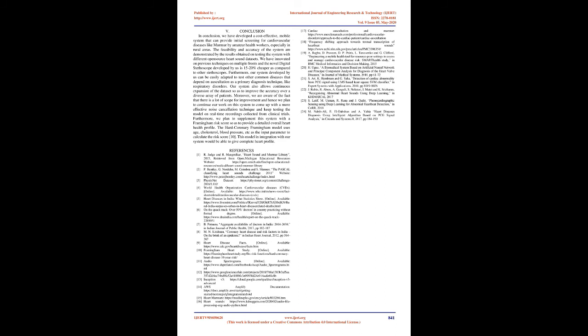PASCAL dataset B: 320 normal and 95 murmur files. After pre-processing, segmentation, and spectrogram conversion, a training set containing 91 images and a validation set containing 21 images was created. After 25 epochs we got a validation accuracy of 80.95%. Few anomalies were encountered due to significant levels of noise in the audio clips.